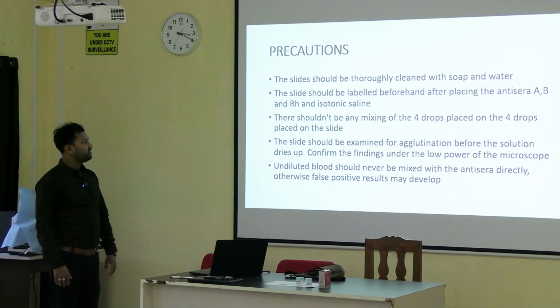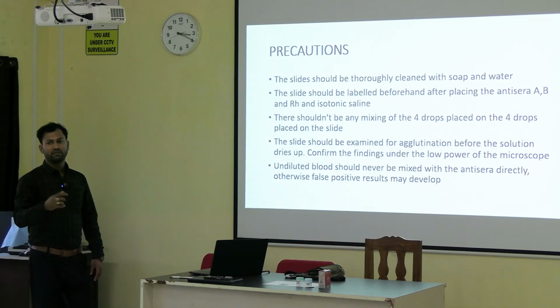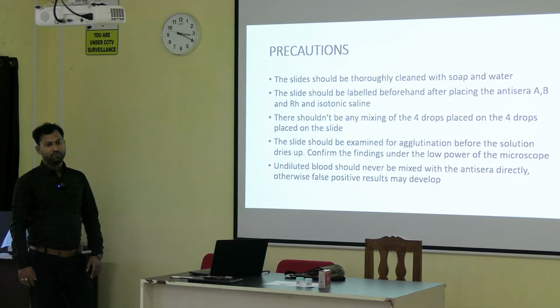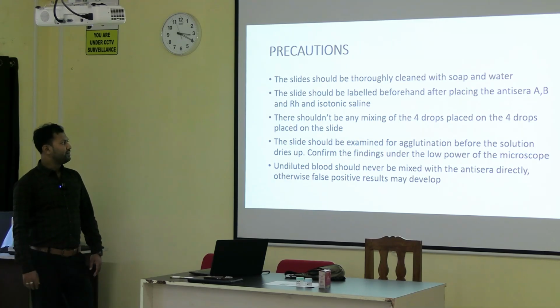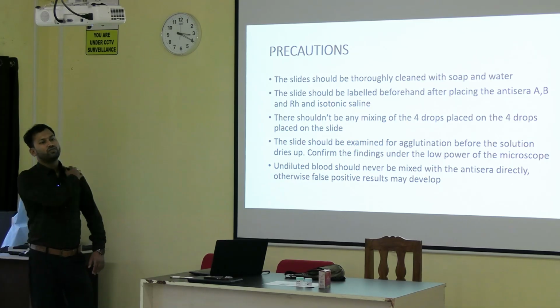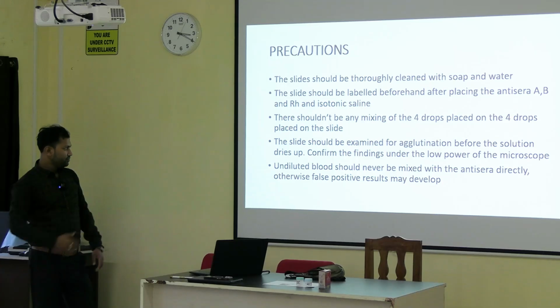There should not be any mixing of the 4 drops placed on the slide. Whenever there are 4 drops, you cannot mix them, otherwise there will be contamination. The slide should be examined for agglutination before the solution dries up. Once the solution dries up, we cannot use it for any further experiment because it is already dried, so there will be no agglutination in it. Confirm the findings under the low power of the microscope, and then confirm these findings under 40x.